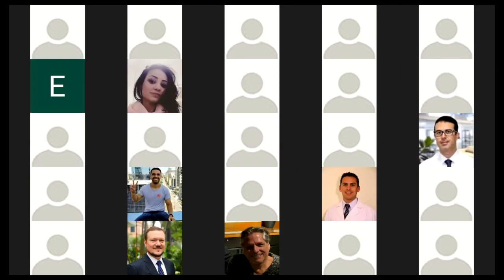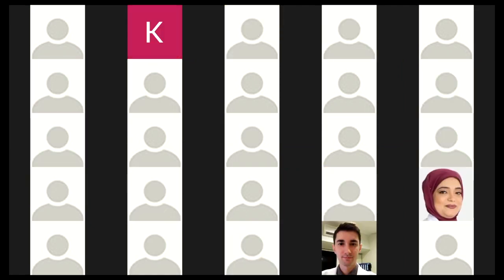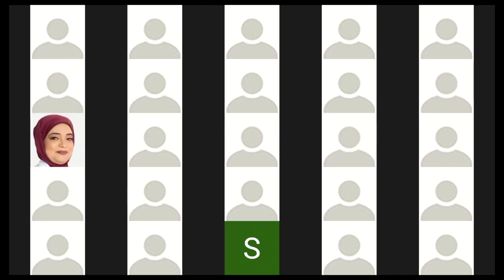So SICS is needlessly making a large incision in this eye where you could have removed the entire lens through two paracentesis with just the vitrector. If I didn't need to put an IOL in the eye, the entire lens could have been removed with just a couple of small incisions. So no SICS, I think it'd be okay if the patient had a very dense cataract. But in this situation, I don't think it's entirely useful.